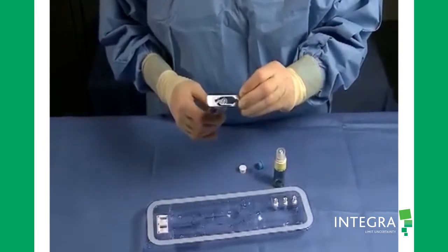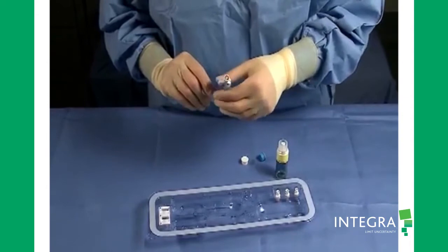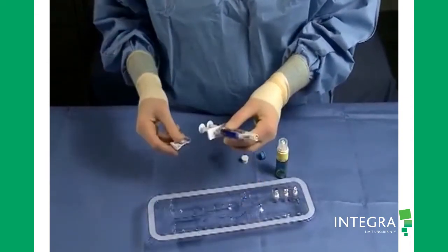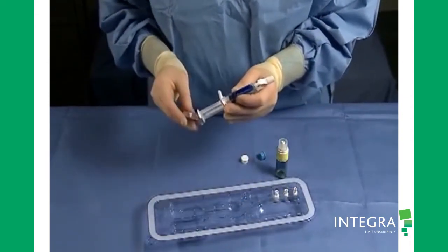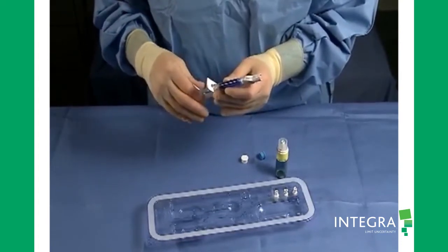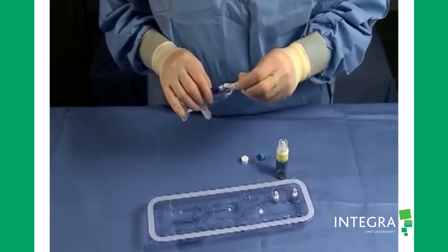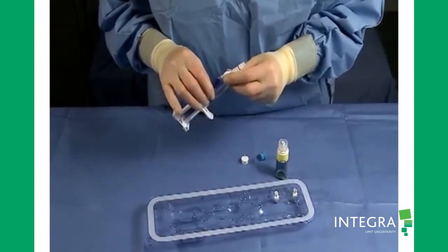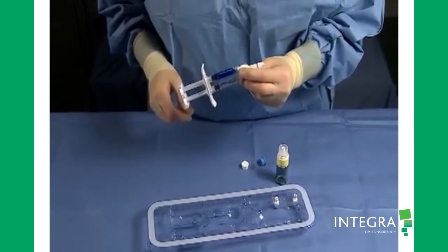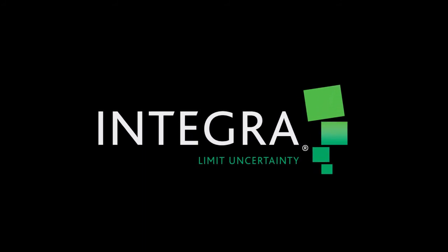Slide the syringe holder over the applicator and syringe barrels. Attach the plunger cap to the syringe plungers. Attach the tip to the DuoFlow applicator. Now we are ready to apply the Duraceal Dural Sealant.